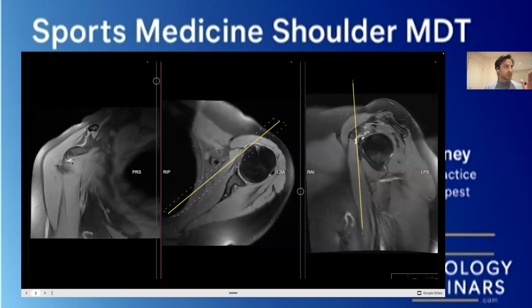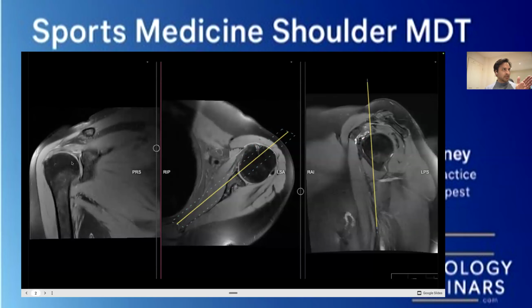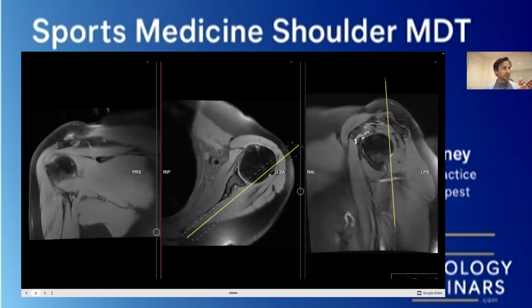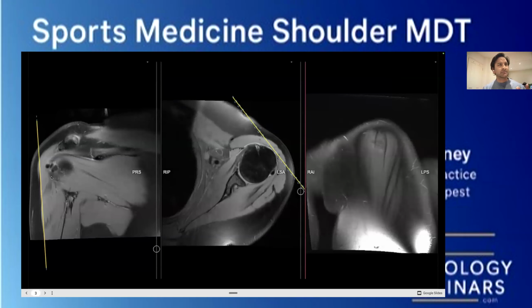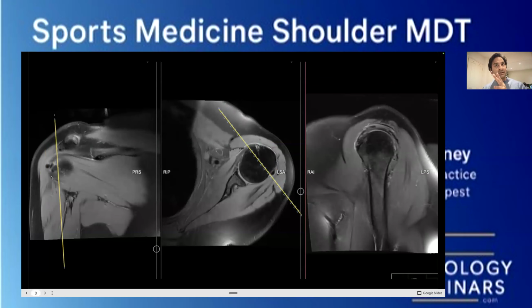So we're here again, looking at the patient from straight on, and let's see if we can find those blobs anywhere else. And there you go. Can you see that? There are some blobs that are sitting right over here. One, two, three, four. There's about four blobs sitting there. Okay, so we've seen it on two views now. So there is something kind of different about this person. We've seen the sagittal views.